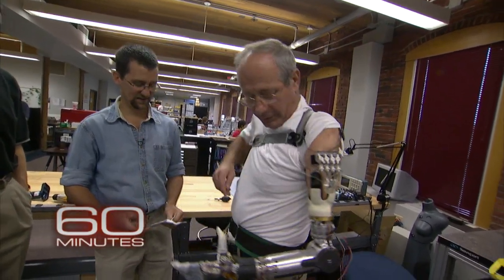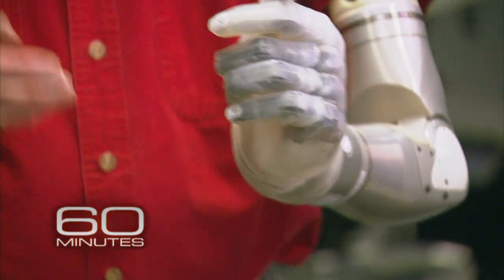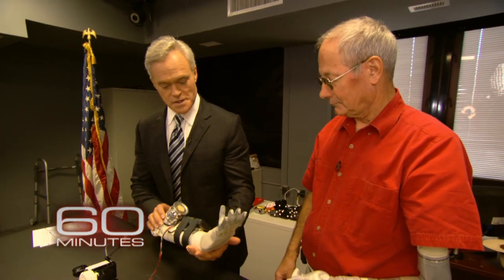That was four years ago. Today, the DECA arm is sleeker, lighter, and easier to control. We asked Fred Downs to show it to us. When we talked to you four years ago, this was the arm — this was state of the art. We were pretty impressed with this.